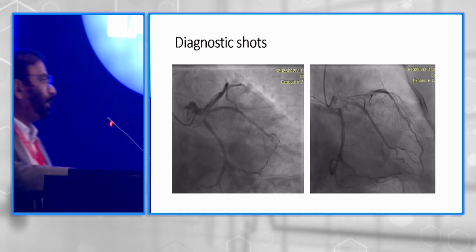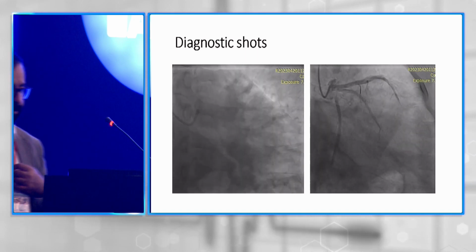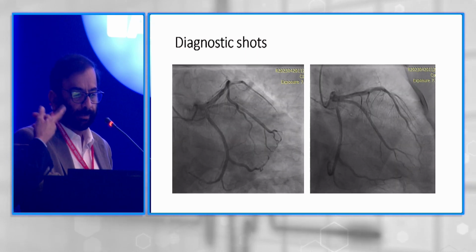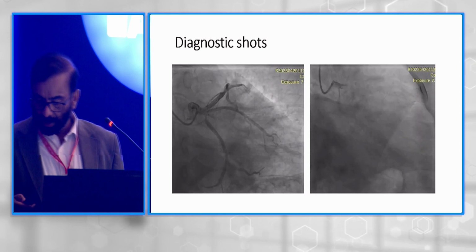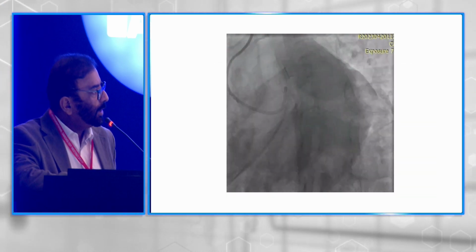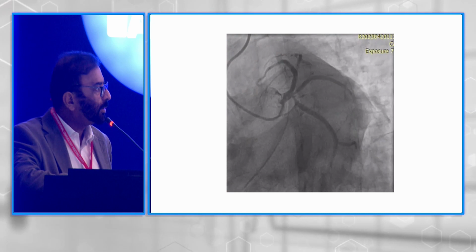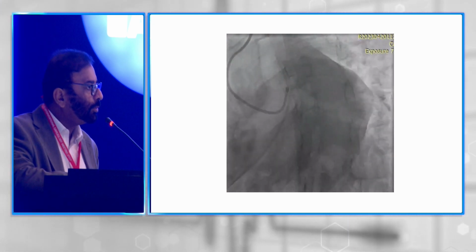Okay, very interesting case, true ostial circ, dominant circ, only the ostium, left main and the rest is clear. From the panelists, Numan, if I ask you, how would you deal with this patient if you were doing the case at that time? Now you can see the spider projection as well. It's very clear: a moderate intermedius and this dominant circ with a tight ostium. Over to Numan.